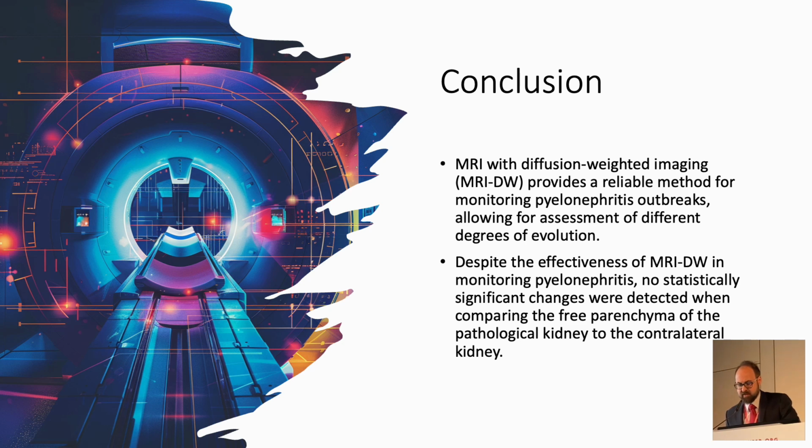Despite the effectiveness of MRI with diffusion-weighted imaging in monitoring pyelonephritis, no statistically significant changes were detected when comparing the free parenchyma of the pathological kidney to the contralateral kidney.